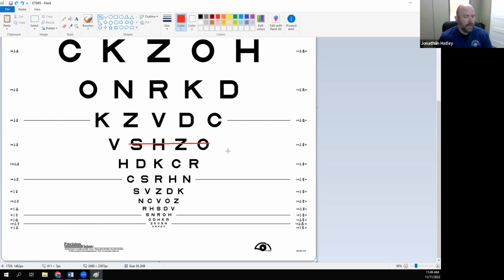So for instance, if the test is conducted at 4 meters, the top number is 4. It's 4 over whatever optotype size the patient read. If they were able to read the 16M optotype at 4 meters, it's 4 over 16M. The nice thing about M notation is that you don't have to do any conversion if you have to change the distance of the chart to the patient. The only thing that you do is put a different distance in there. So for instance, instead of 4 over 16M, if the test were moved up to 2 meters, then you would say 2 over 16M.